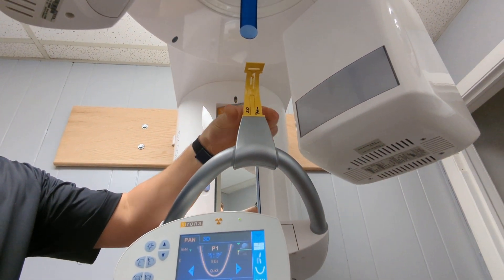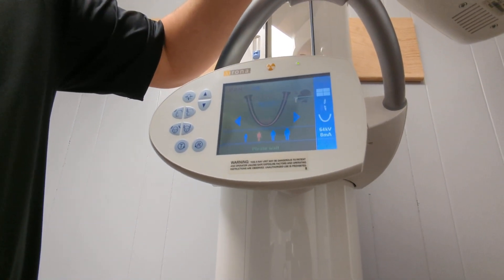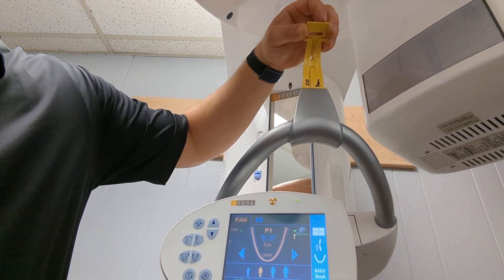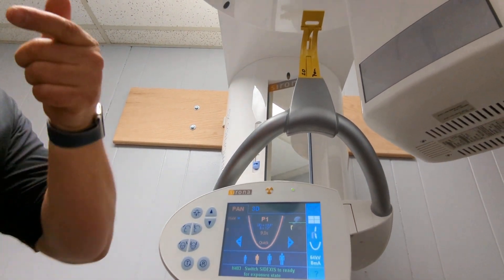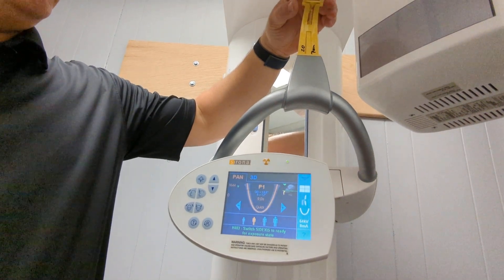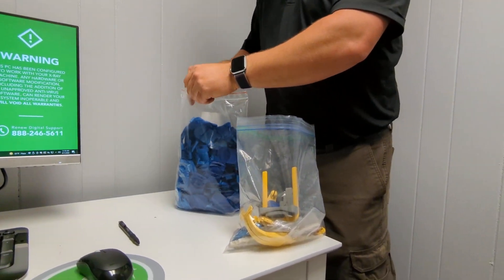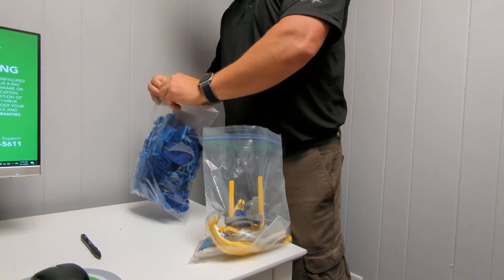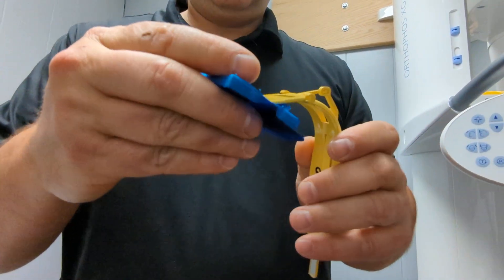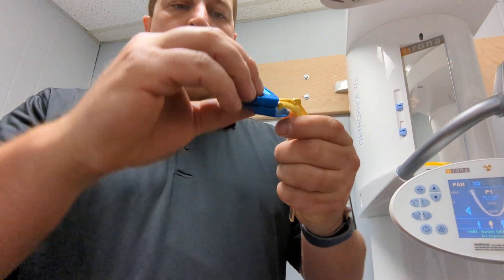It goes in here like that. Right now, notice this little icon right here — when I move this, it's telling you what spot you're supposed to be in. Look at the arrow — it doesn't tell you up or down which is kind of silly. On panorexes you want the patient to tilt down a little bit. You take this and wrap it around — they bite on that and that tells you where you're at.